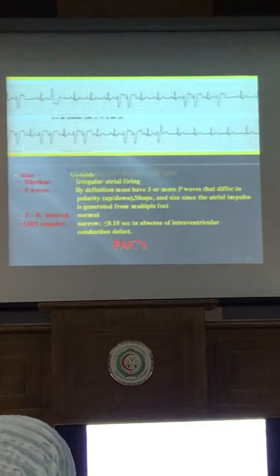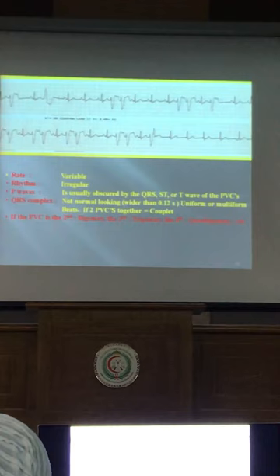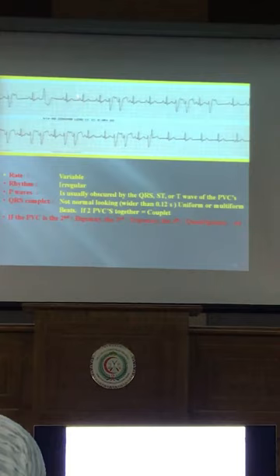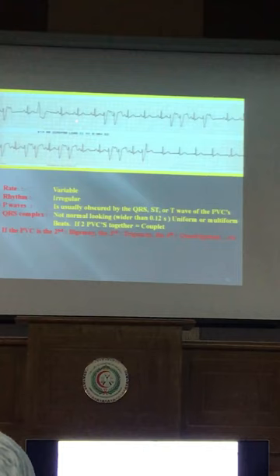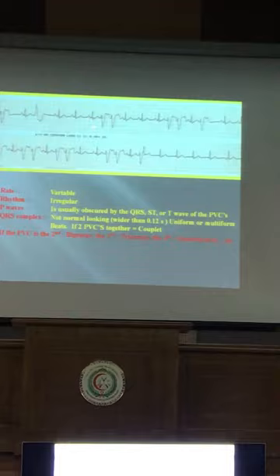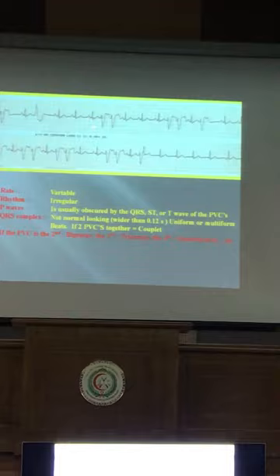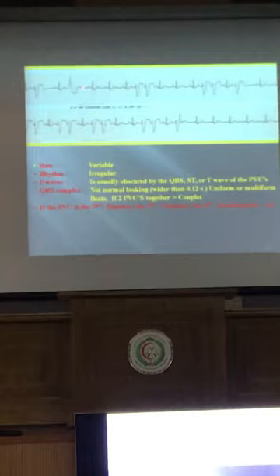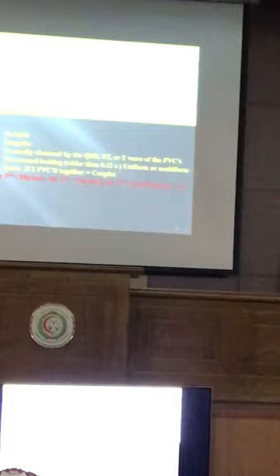What is this? Multi-focus PVC. Look at the P wave — P is present and positive, so the rhythm is sinus. But there is different QRS morphology, and these beats come early. The interval between normals is long — one, two, three, four — but here only two. So it comes early with different QRS morphology and a compensatory pause behind. This is sinus rhythm with premature ventricular contraction.